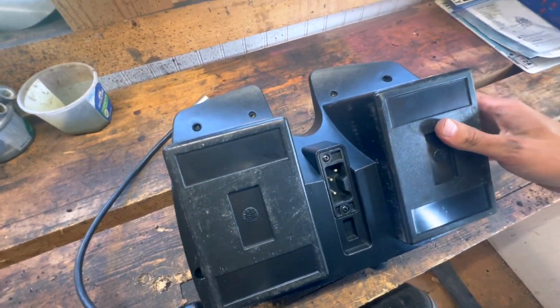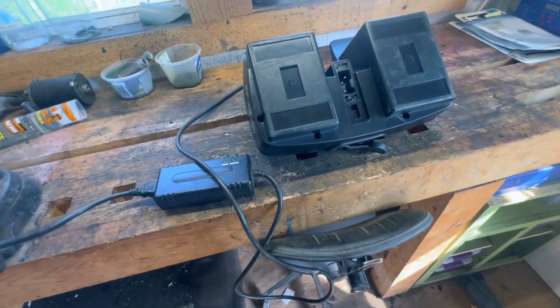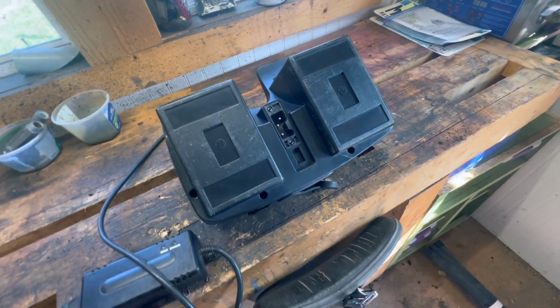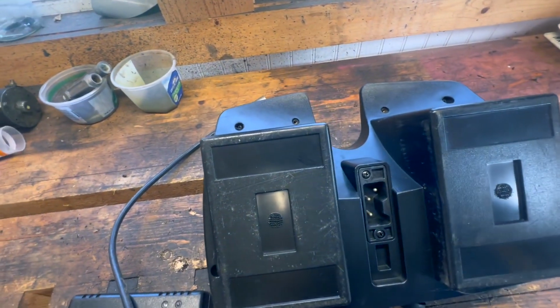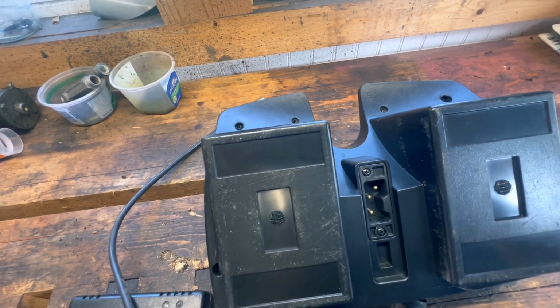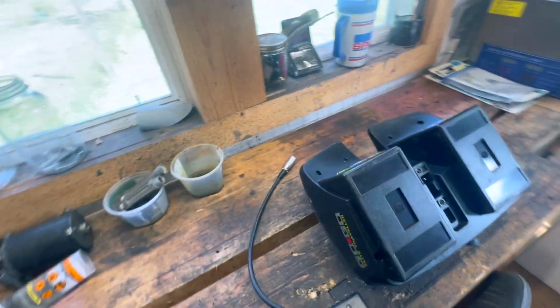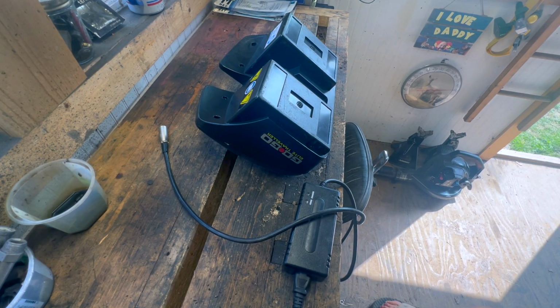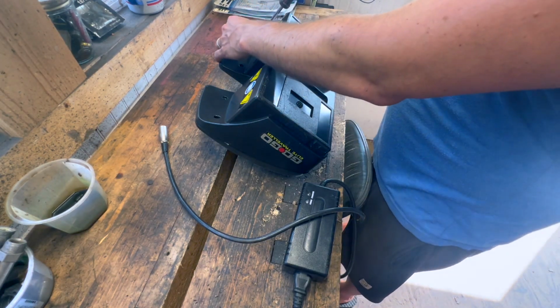But I figured that, you know, before I spend any time really looking at the scooter itself, or I don't even know what you want to call it. Is it an electric wheelchair? Is it a mobility scooter? Whatever. I figured the batteries are probably going to be the biggest issue. So let's just zip these screws out, split the case open, and see what we got going on. Because maybe we just need to get some replacement batteries. And I don't even know what kind of batteries are in here.